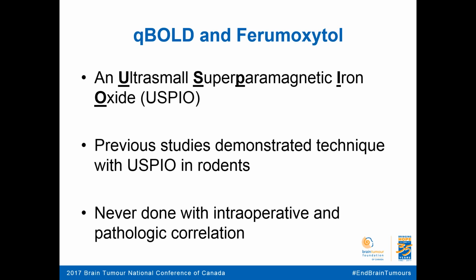All we do in MRI is change the magnetic field to see how the tissues react and to image that. So we are using that characteristic of having iron in blood vessels. So we're technically using an iron supplement as an MRI dye. This was done in a limited fashion in animal models, but nobody actually proved what it showed. There are studies in animal models that say, okay, this part of the brain is different, but we don't know what that difference means.